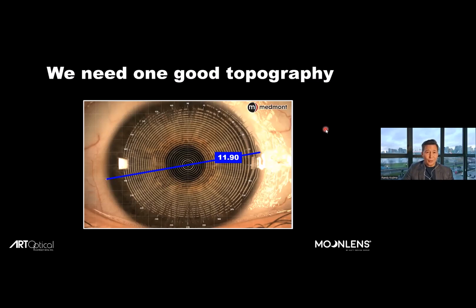Just having the right size, such a simple thing that we do in custom lenses, but I mean, how often do we think about VID and contact lenses in general? In orthokeratology, really critical to our success.